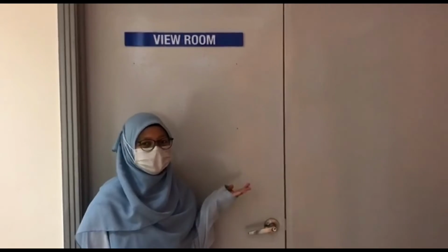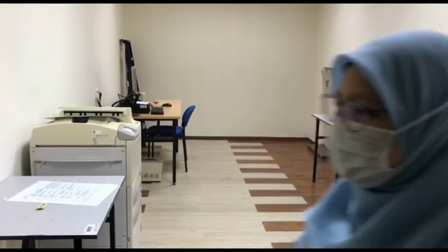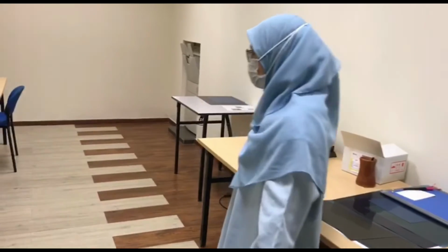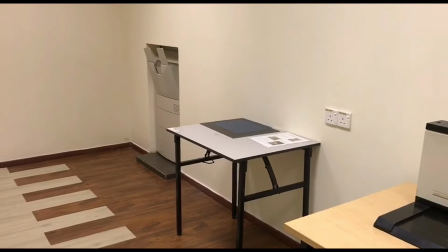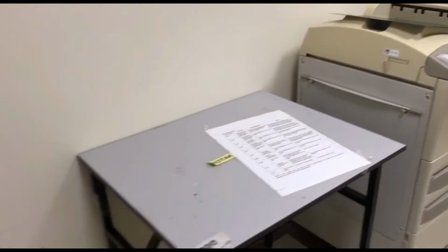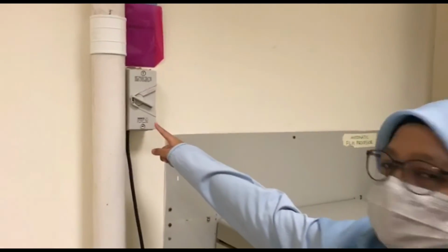So this is the view room. So let's go inside. So at this area, this is where we have our identification camera. There, this is the identification camera, and then also our darkroom processor, the outside one, where the film will come out. So if we want to switch on this processor, this is where the switch and off button.